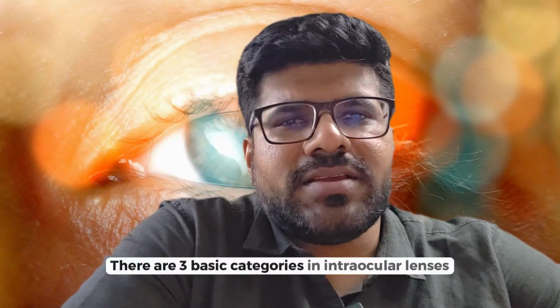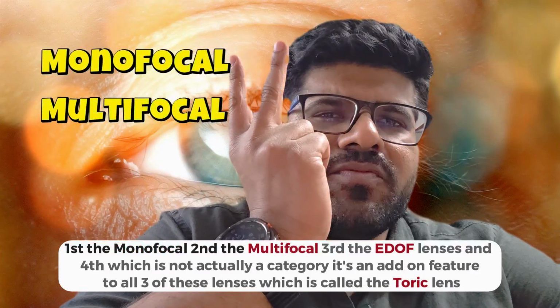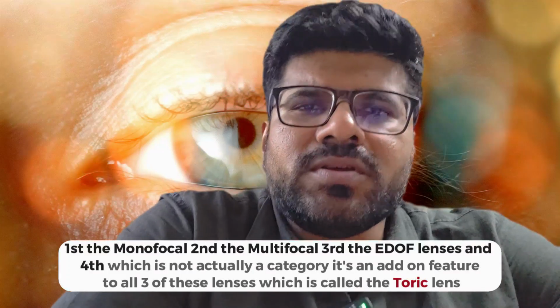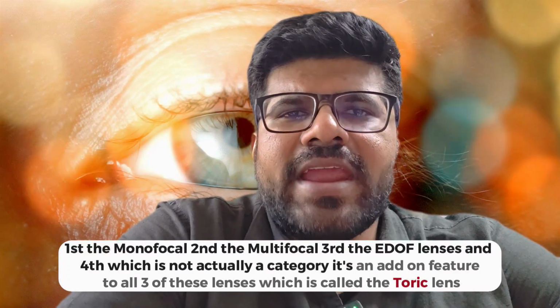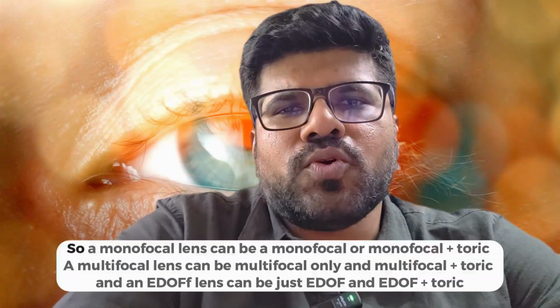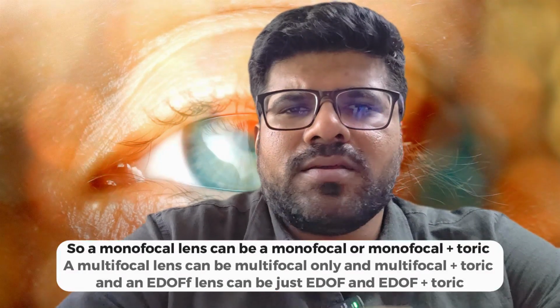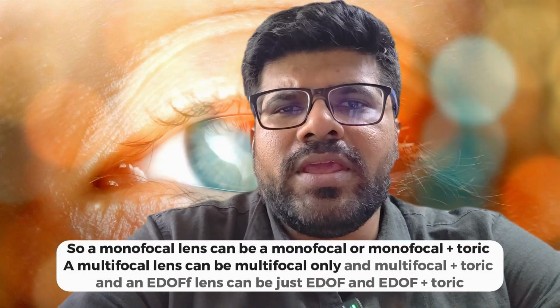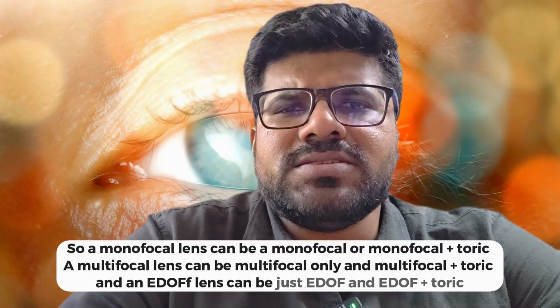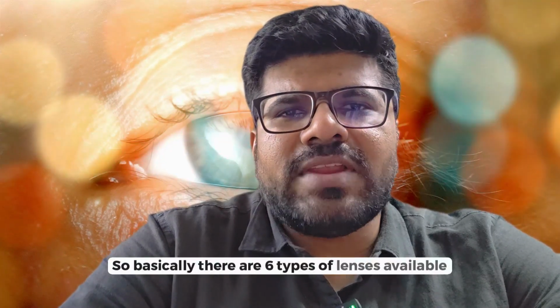There are three basic categories in intraocular lenses. First, the monofocal. Second, the multifocal. Third, the EDOF lenses. And fourth, which is not actually a category, it's an add-on feature to all three of these lenses, which is called the toric lens. So a monofocal lens can be monofocal or monofocal plus toric. A multifocal lens can be multifocal only and multifocal plus toric. And an EDOF lens can be just EDOF and EDOF plus toric. So basically there are six types of lenses available.